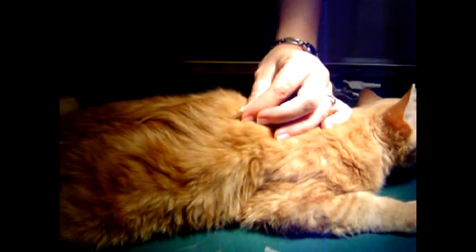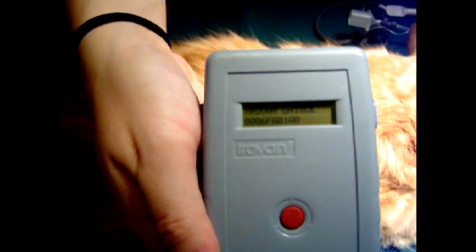And then we're going to check it and make sure that it's there. And that's how we microchip.